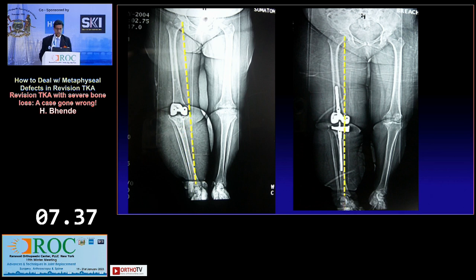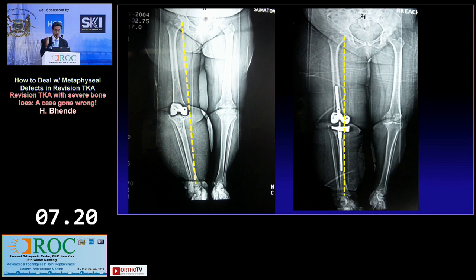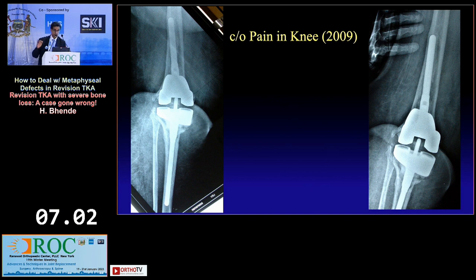Comparing before and after revision, you can see there was still some residual varus left uncorrected. The problem was that without offset rods you cannot change alignment — with a straight rod the implant aligns according to the shaft. We didn't have much option for correcting the overall varus. She continued walking and was good for the next three to four years, but then started getting pain again, with the femoral side becoming loose — you could see a wiper effect on the femoral stem.